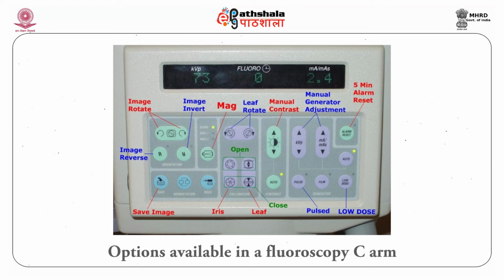Adjust acquisition parameters to achieve the lowest dose necessary to accomplish the procedure. Use the lowest dose protocol possible for patient size, lower frame rate, minimize magnification, reduce length of run. Operator and personnel hands should be out of the beam.